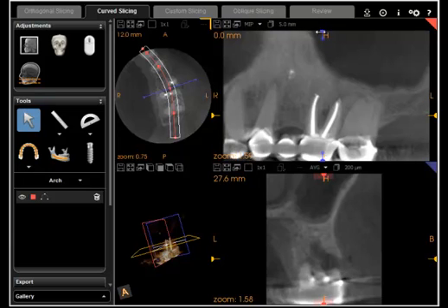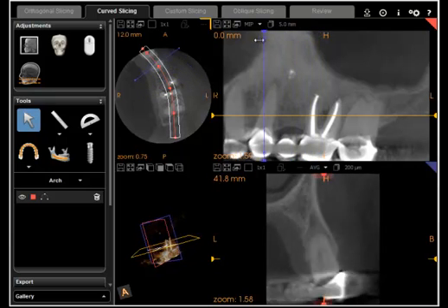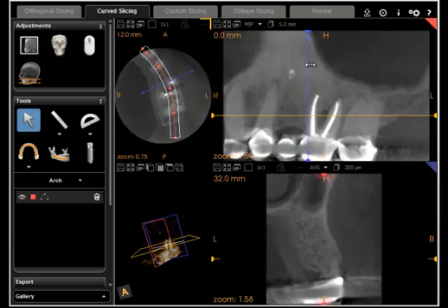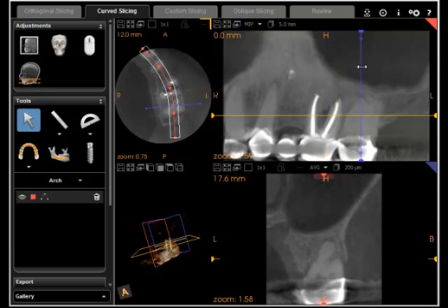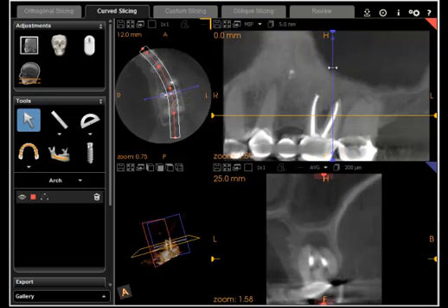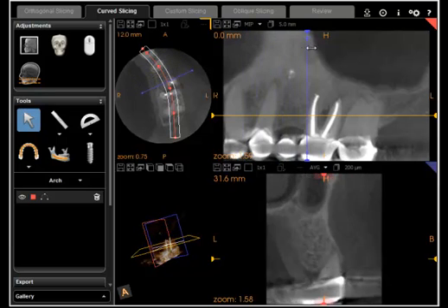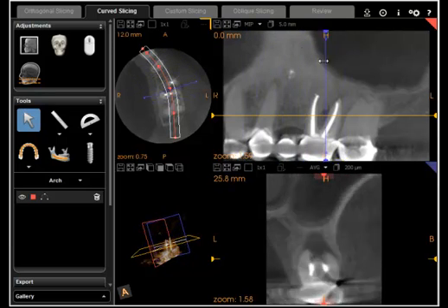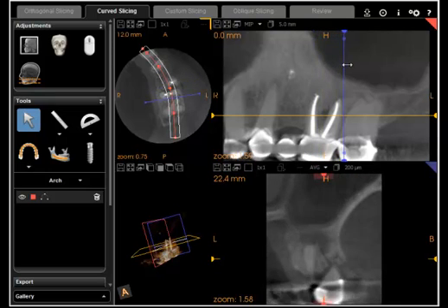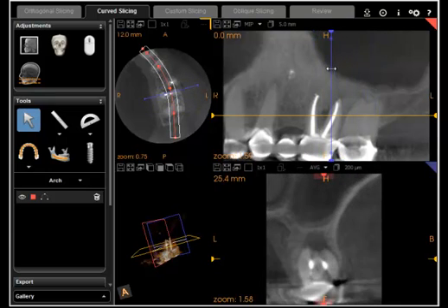Now that you've created that slice, mouse over this semi-circle that's blue and hold the left mouse button down. You're now able to move that slice back and forth. As you can see on the axial slice, you can see where that slice is moving and where that cut is, and in the view you can see the effect of moving the slice.